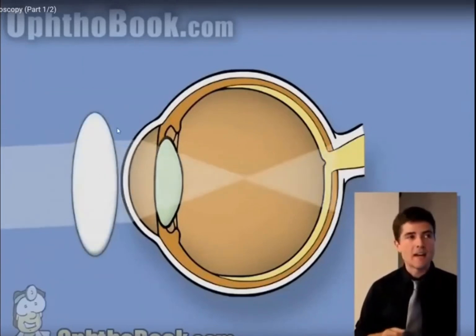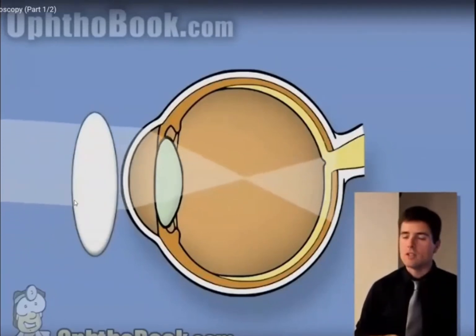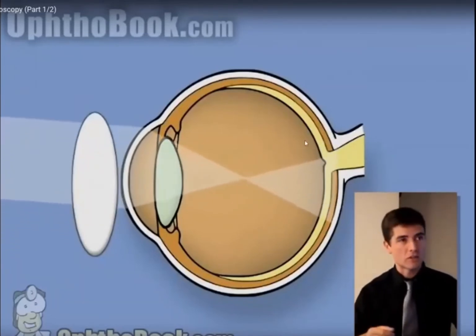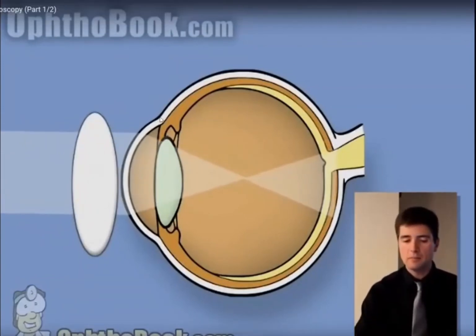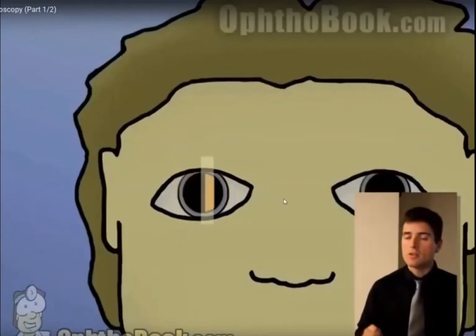Now, if you have myopia, then it becomes opposite. When you swing the light back and forth, you get an against movement. So when you swing the light to the right and the image moves towards the left, then that is an against movement. So that means that there is myopia. So this is what it looks like at the front. If you're moving the light towards the left here, and the reflex is moving together with the swing, that means there's hyperopia.